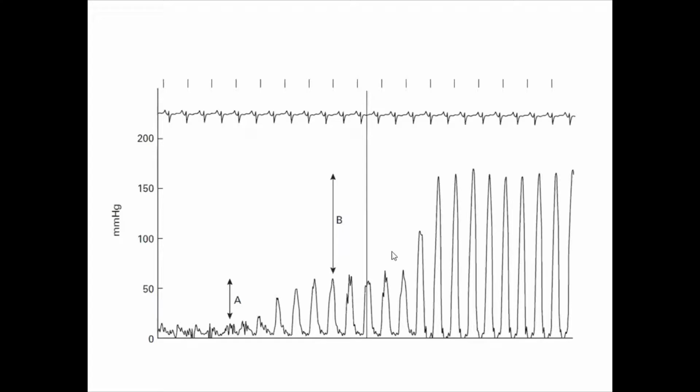There is a significant gradient between the pulmonary artery and the RV. If you concentrate here, maybe the shape is similar to this one. So the shape in the middle is similar to the shape on my right hand, and overall it resembles a ventricular hemodynamic tracing. So it looks like RV.